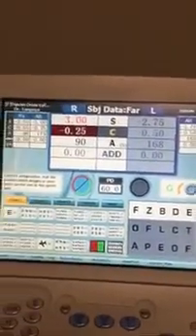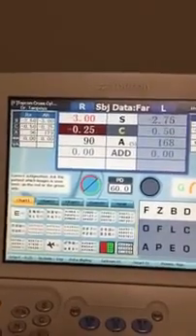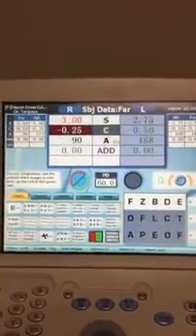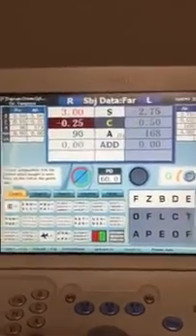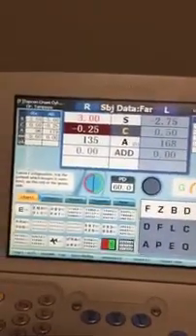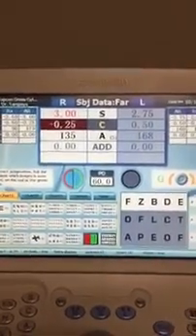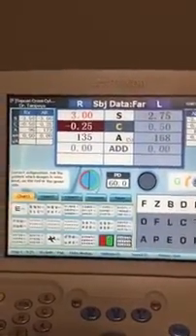Okay, so let's ask again. Upper right, red, or lower left, green. So we're always thinking about what the patient sees, not our view. And they say green again. Let's go to 135. Okay, now, we'll say which side is more clear, the right side on the red, the left side on the green. Let's say they say red this time, the right side.